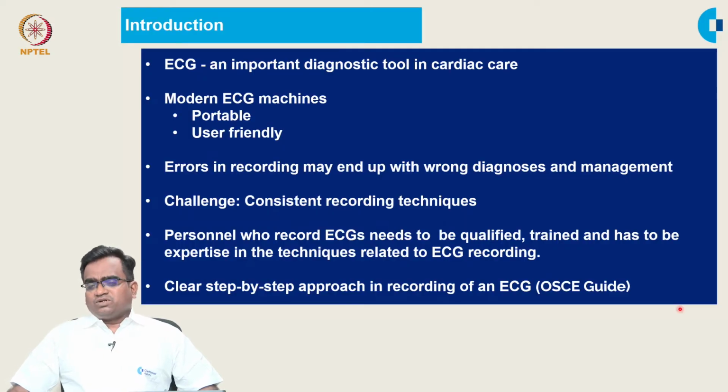ECG is an important diagnostic tool in cardiac care. Modern ECG machines are portable and very user friendly. But even though it is a user friendly device, errors in recording an ECG may end up with a wrong diagnosis, and it will also affect the management of cardiac diseases. So, the greatest challenge in recording an ECG is that a consistent recording technique must be adopted.